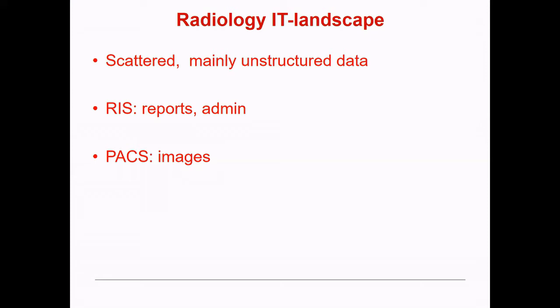And then the PACS, or Picture Archiving and Communication System, is the server where usually the images reside, and they are often stored in the DICOM format. There's a DICOM header in the PACS that describes a lot of features that I'll go into in a second. It's called a Picture Archiving and Communication System because oftentimes on top of this server, you also have a graphical user interface for image interpretation and reading of the studies.